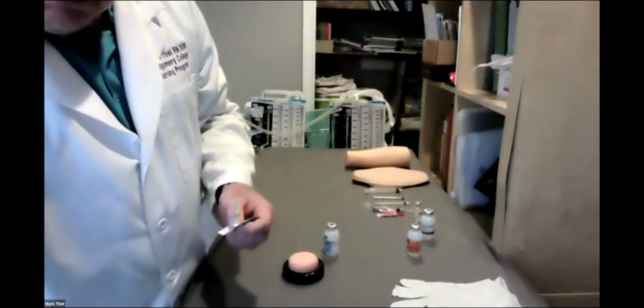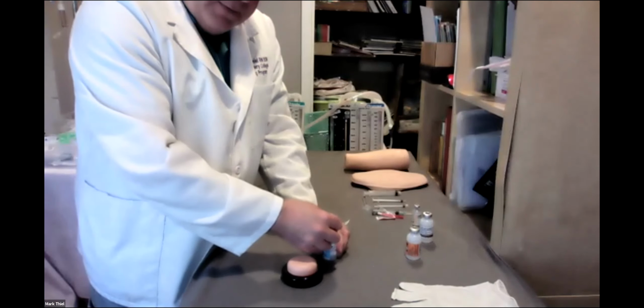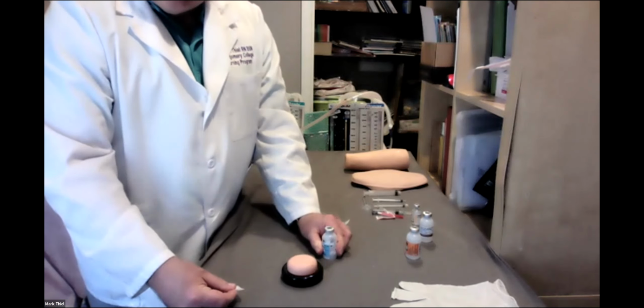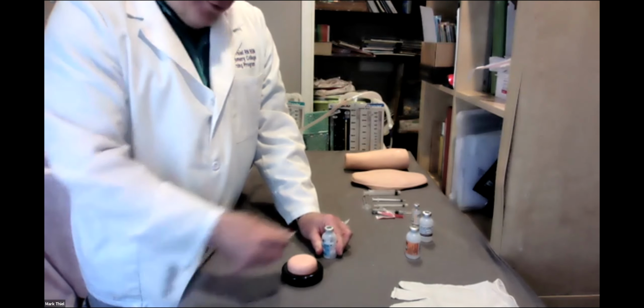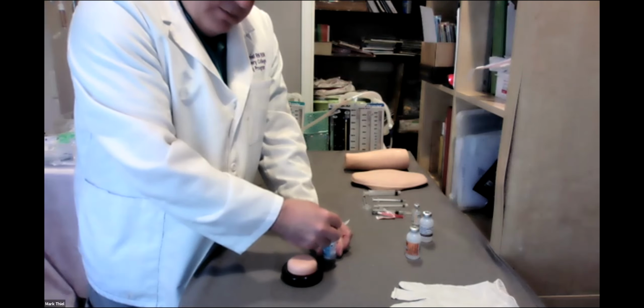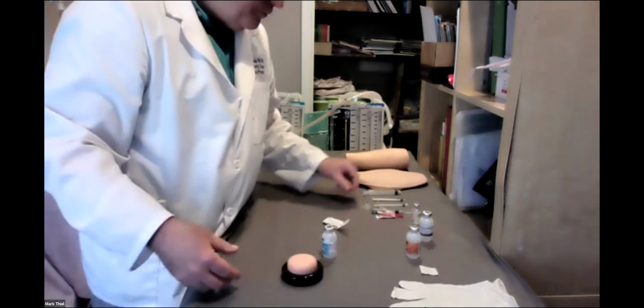Intramuscular, what I had promised you. Rubbing, to the count of 30. Okay, we'll do that. And there we have it.